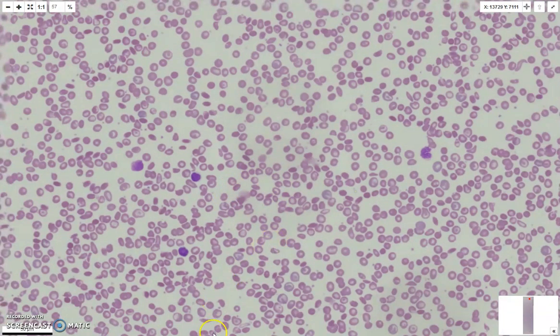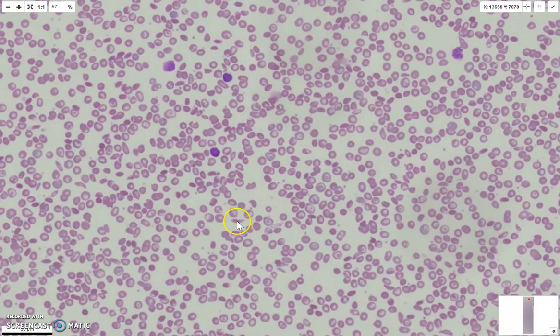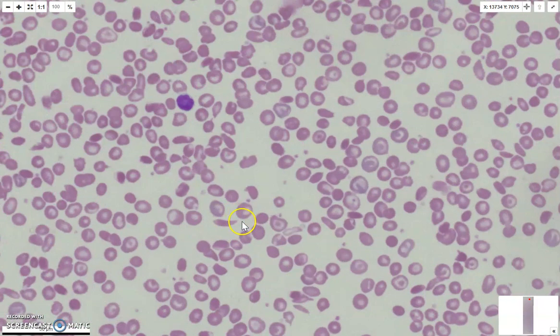So when they start getting polymerized, there's not enough oxygen in that red cell, or they're in a deoxygenated state, and so they're quite fragile and not as soluble or malleable. They can't deform as well and go through the vessels, so they're quite rigid, and then they get destroyed as well. So here's one there, there.